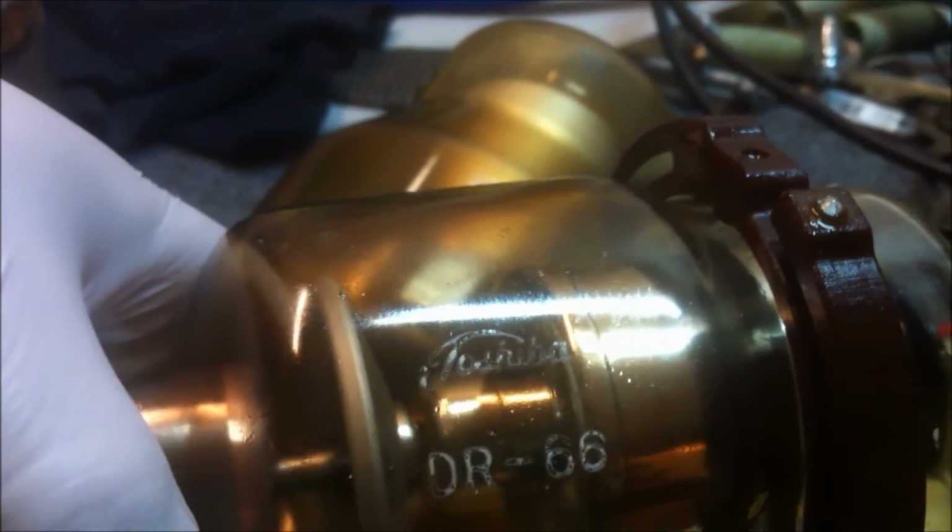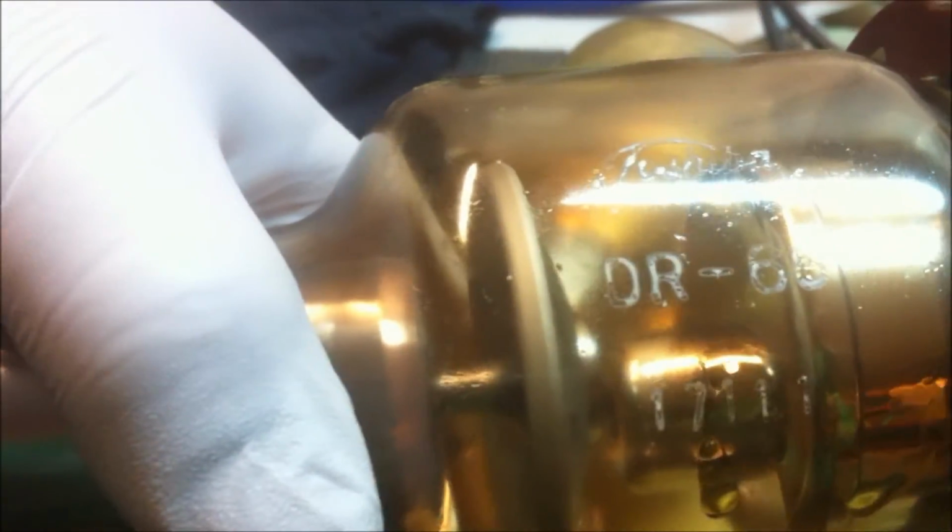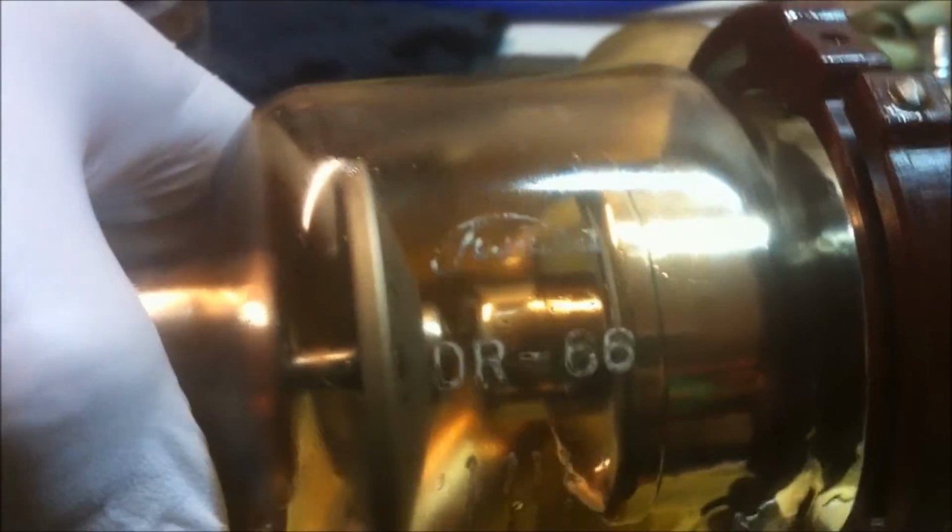This particular X-ray tube is a Toshiba DR66. There's a stamp on there, 17111. So yeah, Toshiba DR66.